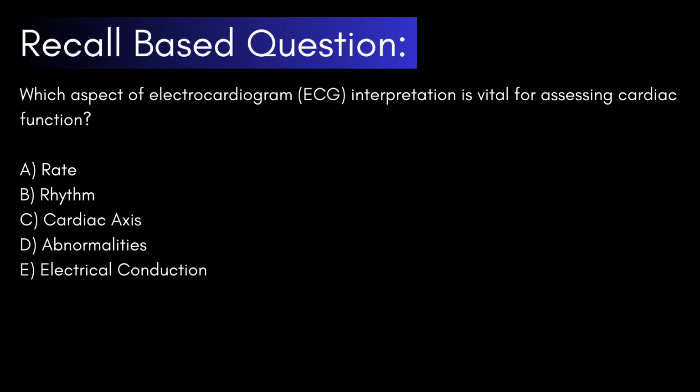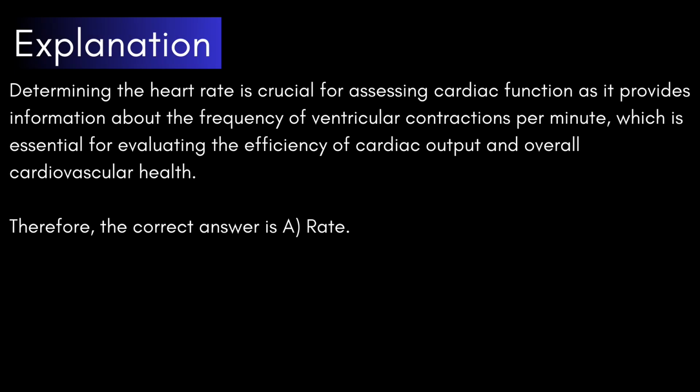Otherwise, moving on now. Determining the heart rate is crucial for assessing cardiac function as it provides information about the frequency of ventricular contractions per minute, which is essential for evaluating the efficiency of cardiac output and overall cardiovascular health. Therefore, the correct answer is A, rate.